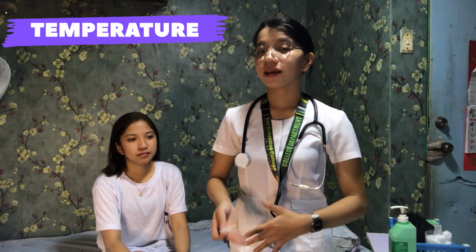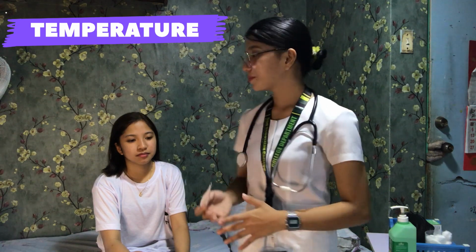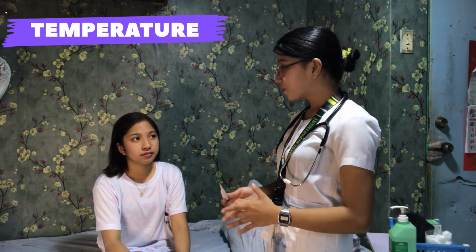After disinfecting the digital thermometer, I'm going to take a look if the area has scars or lesions, and pat dry if the area is wet or moist.